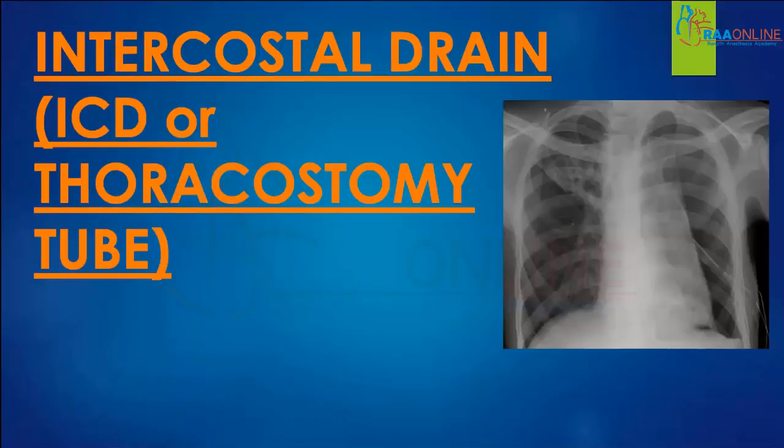In this presentation, I'll be talking about the management of an intercostal drain. Intercostal drain, also known as a thoracostomy tube or ICD. It's one of the commonly performed procedures in the medical ICU as well as in the surgical ICU, especially in the cardiac surgical ICU, as well as for patients in the emergency room who have been victims of road traffic accidents or any trauma.